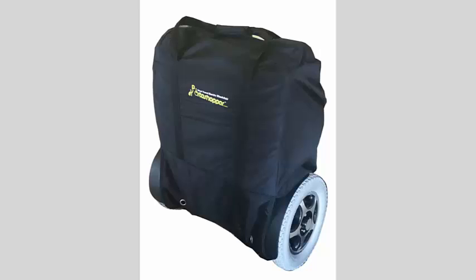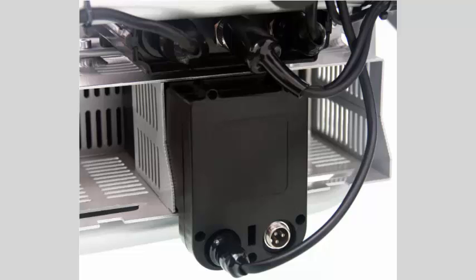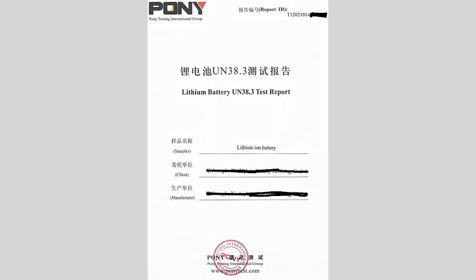Furthermore, we also include a free heavy duty padded nylon travel bag and a large capacity shopping bag that hangs from the backrest and attaches with Velcro. All our products have flight friendly lithium ion batteries and we provide you with the technical information required to get your wheelchair onto the plane when travelling by air.